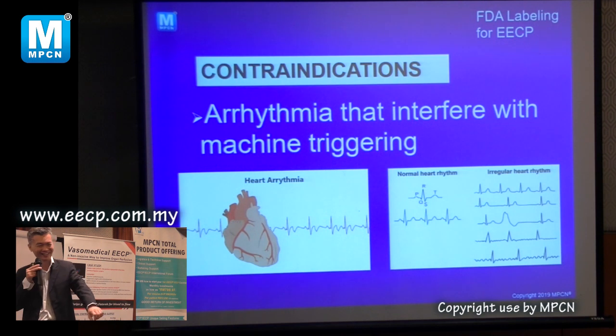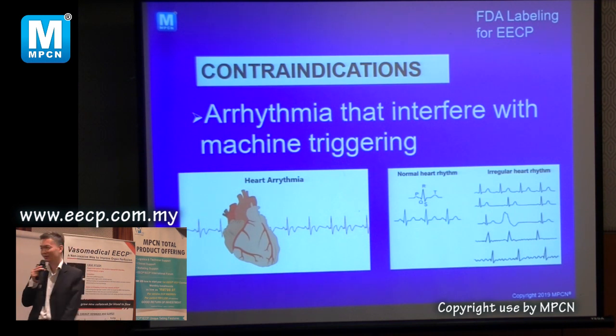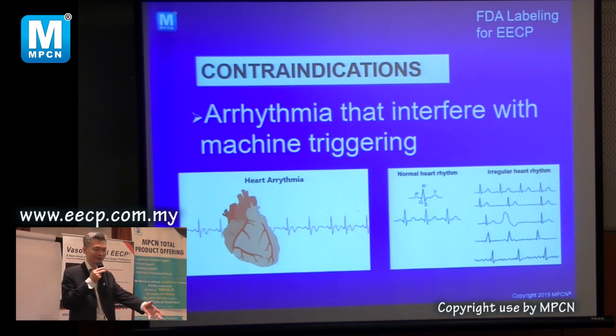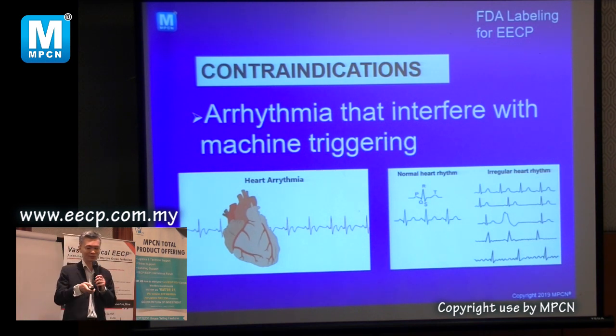So we have to keep holding it. So the staff have to hold him. At first we discovered that. Then later we bought some of this earth wiring thing. I don't know whether you can put that on and reduce the static, and then it can work. So some humans have this static electricity that can cause this, but it's not common.